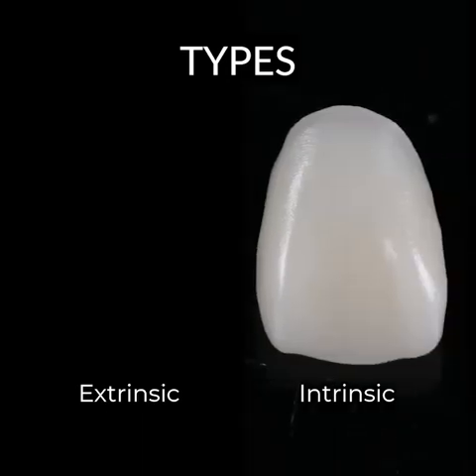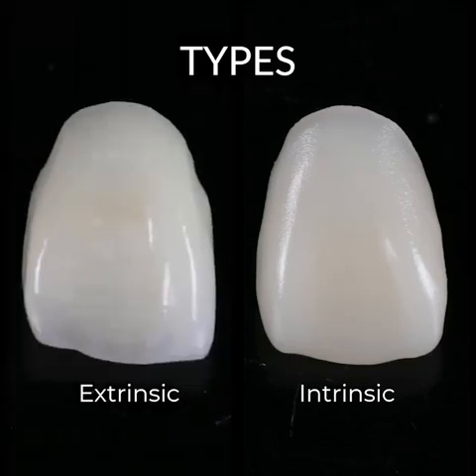The first type is the natural translucency of the ceramic, or its intrinsic property. Here on the right is a CAD/CAM ceramic restoration that was milled and then immediately fired without any post-processing. It has some translucent characteristics, but it's uniformly translucent, and for the most part, our natural teeth aren't like this. So we can enhance the translucency in some parts and then reduce it in others, like this one on the left. Now, when I say to enhance and reduce translucency, that is in fact impossible, because the ceramic structure did not change really in any way.